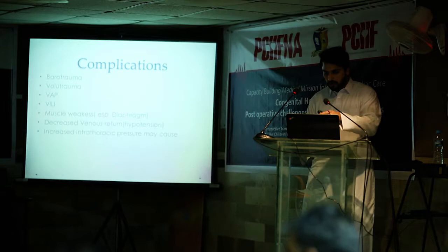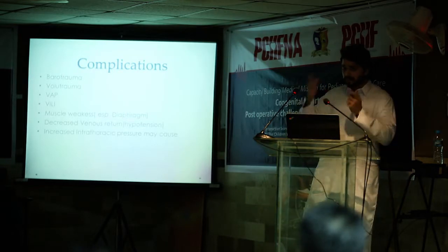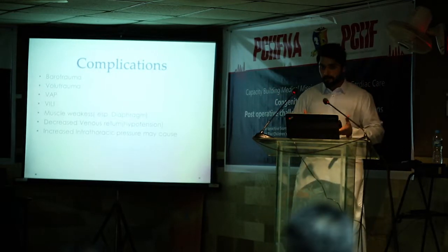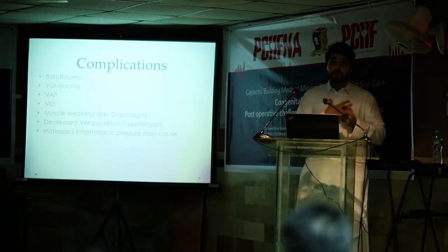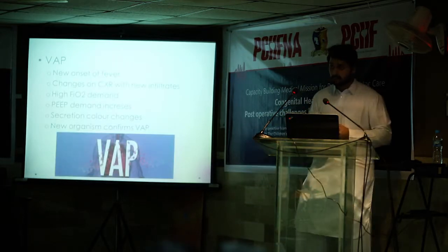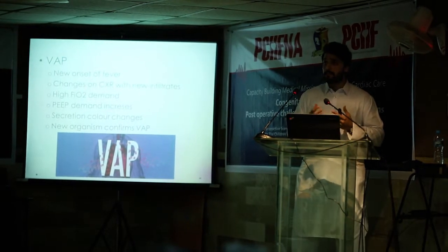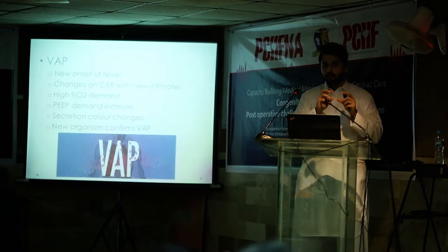All right. So the last thing I will talk about briefly, these are some complications of mechanical ventilation: barotrauma, volutrauma, volume-induced lung injury, VAP, ventilator acquired pneumonia, and decreased venous return or decreased BP, the same thing. So these are some complications. I will just briefly talk about the VAP, which is the most important thing, and it's all around the world. So VAP means what? VAP means ventilator acquired pneumonia. How can we diagnose VAP?